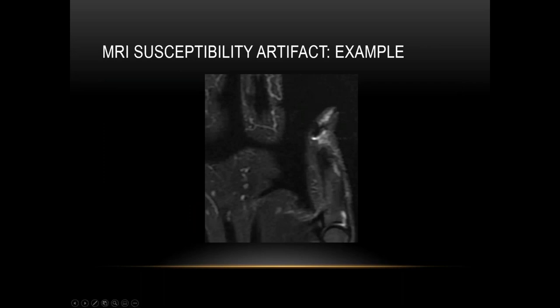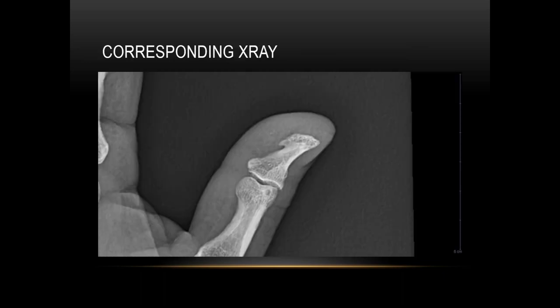Here is an example of an MRI of a thumb showing a susceptibility artifact that appears to indicate a large foreign body — but this is very deceiving. The corresponding x-ray shows a very tiny, perhaps less than one millimeter radiodensity, possibly metallic, that accounts for that artifact.